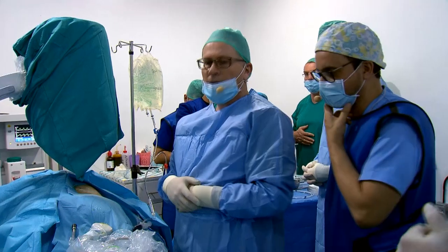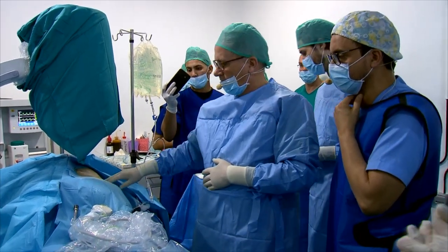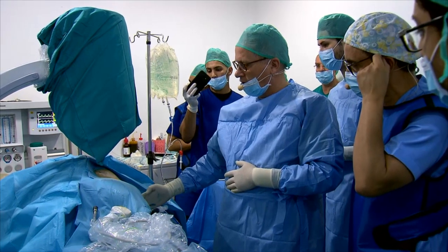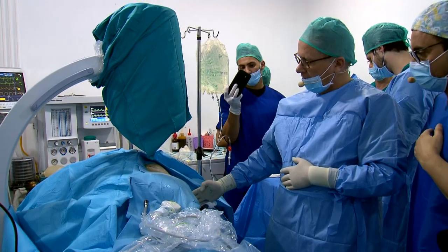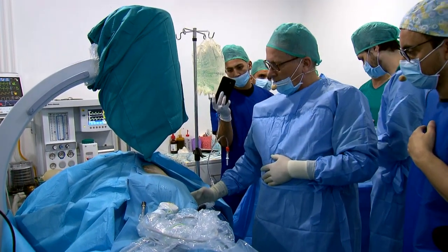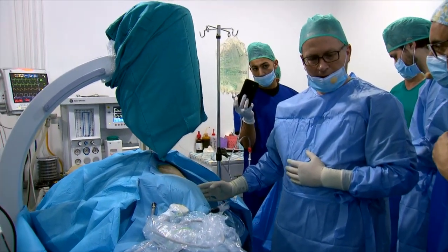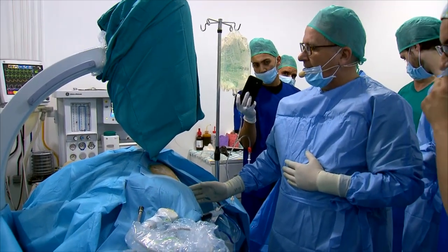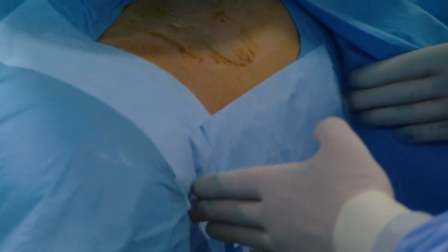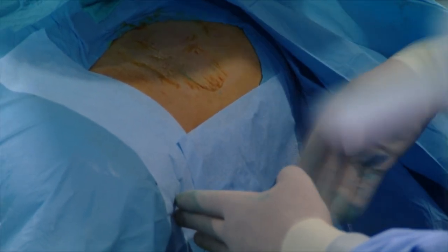Okay, now we can start. We placed the patient into prone position, and we placed the cushion exactly in the area of the kidney. There are two possibilities. We can put the cushion like we did in the center of the kidney, which leads to a certain fixation of the kidney. This is suitable if you perform an ultrasound-guided puncture. The second possibility is to have two cushions, one under the pelvis and one under the chest. If you have two cushions, you have a mobile kidney.